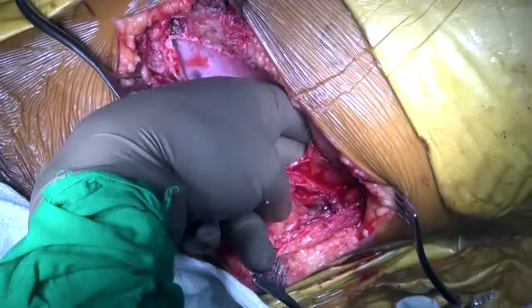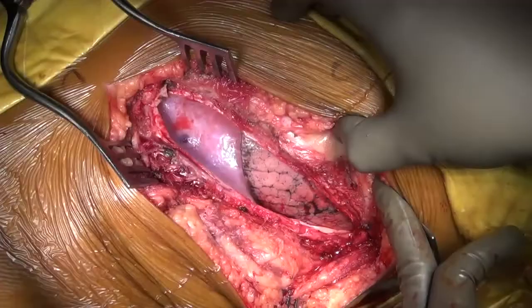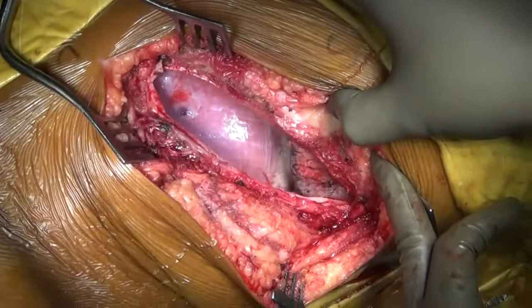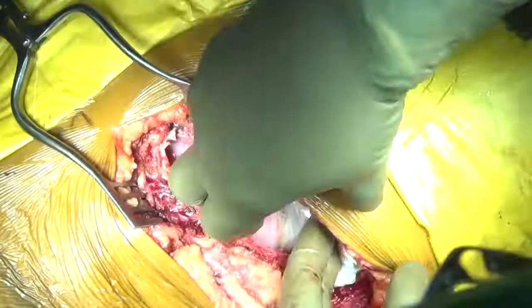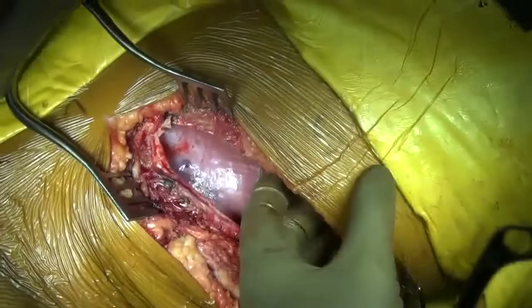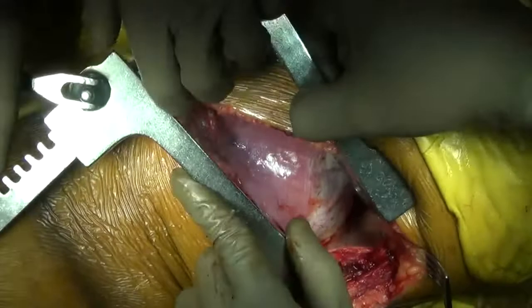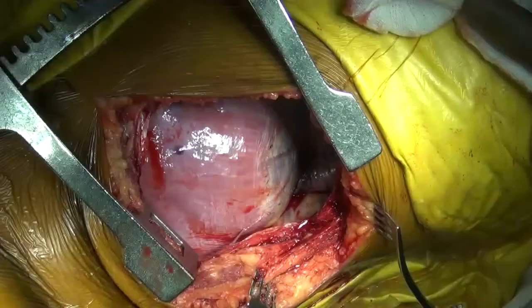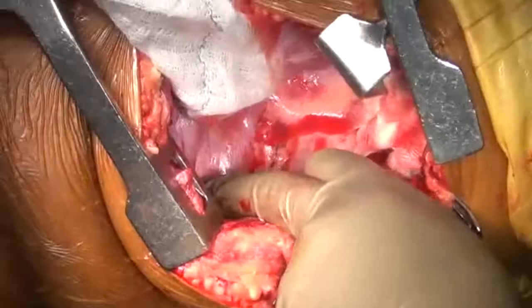I am inserting my fingers inside to protect the lung tissue and underlying structures while completing the incision. It is imperative to inform the anesthetist when opening the pleura. After opening the pleura, make sure there are no adhesions between the lung and the underlying pleura or diaphragm, which can occur in tuberculosis. The self-retaining chest wall retractor is then inserted, opening the cavity sufficiently to get good visualization of the glistening diaphragm and underlying structures. We need to identify the crus of the diaphragm, the aorta, and the 12th rib.